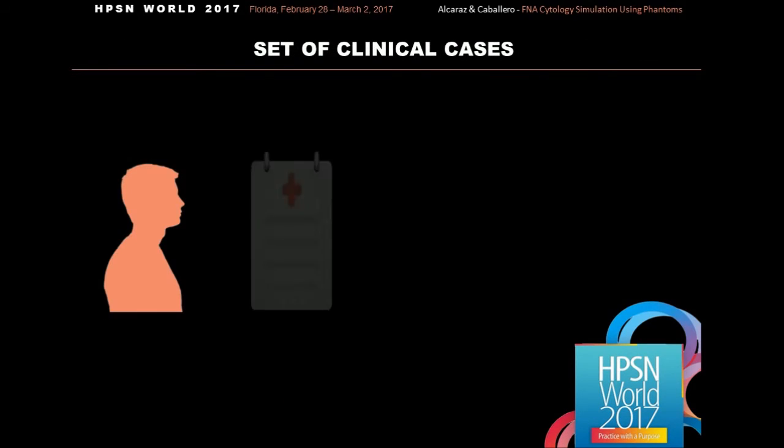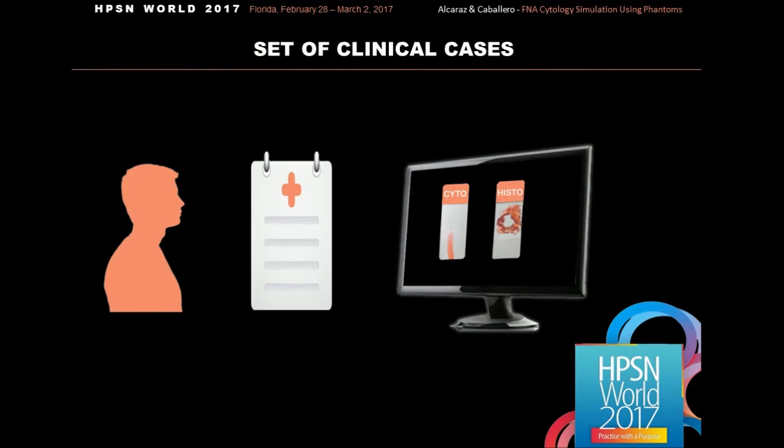Currently, we have a set of 50 cases, which include a profile of the patient with a picture, a clinical background, and the digitized slides, both the smears and the biopsy. Do you have any experience with digital pathology?